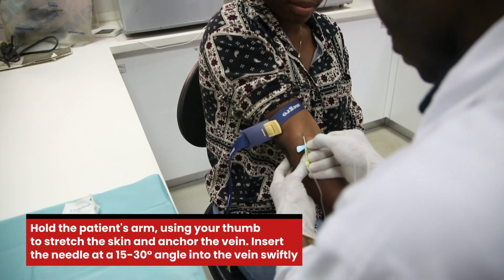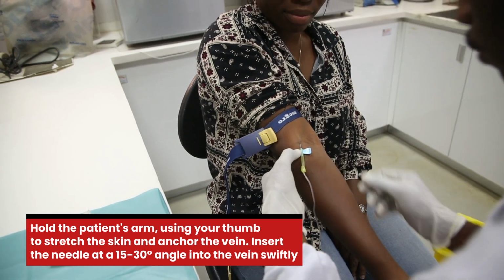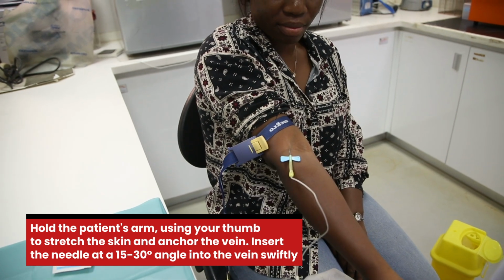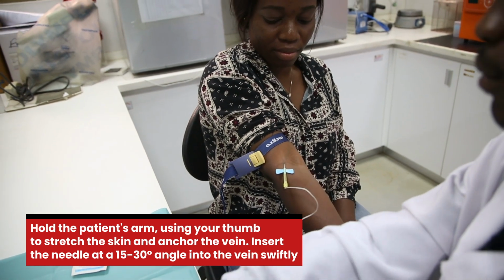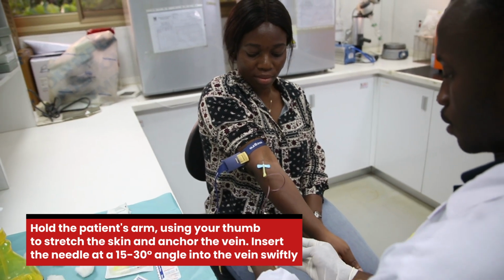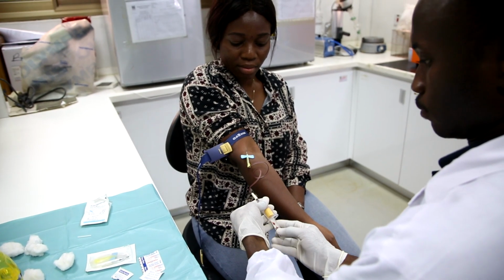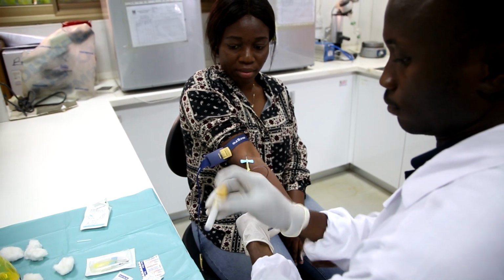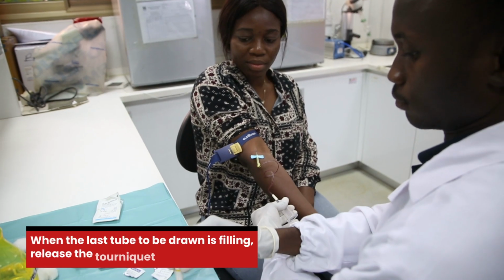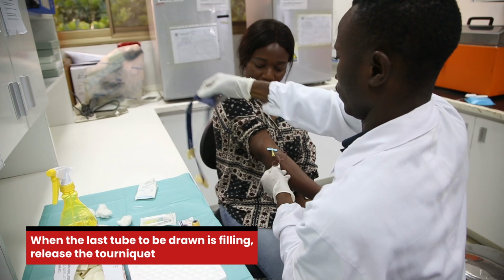Now, grab the patient's arm firmly using your thumb to draw the skin taut and anchor the vein. The needle should form a 15 to 30 degrees angle with the surface of the arm. Then, swiftly insert the needle through the skin and into the lumen of the vein. When the last tube to be drawn is filling, release the tourniquet.